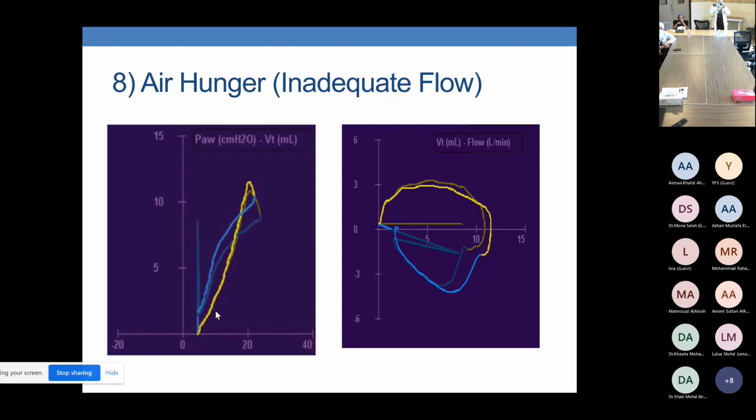So please, whenever you are putting SIMV, the new ventilator modes have a PSV mode. Usually you put the PSV at half of your required PIP, or a minimum of 4 to 6, to overcome the ET tube resistance. At least you want to let the baby breathe, but also help him to overcome the ET tube.